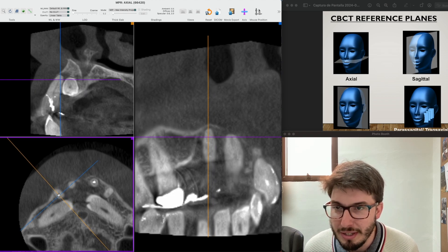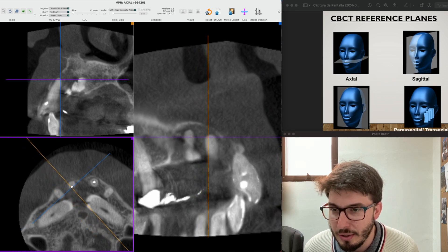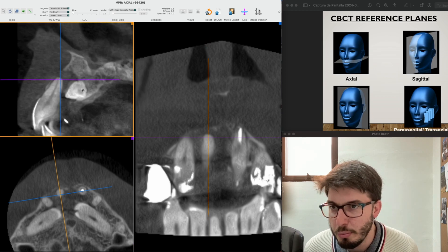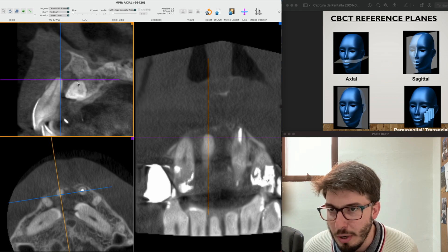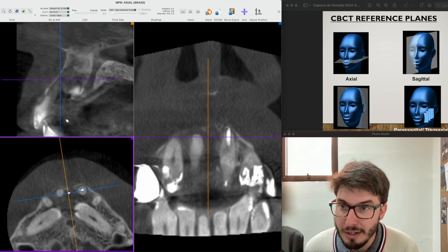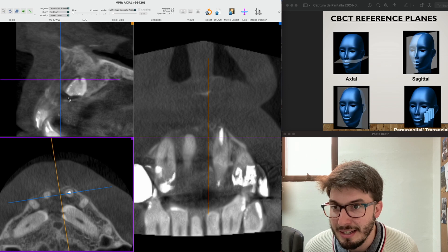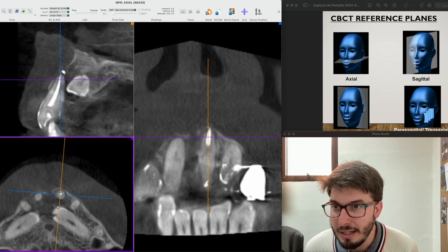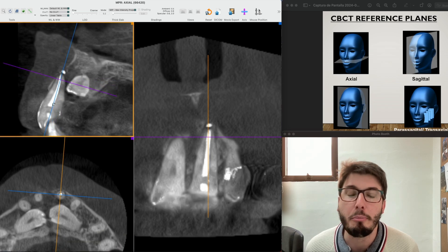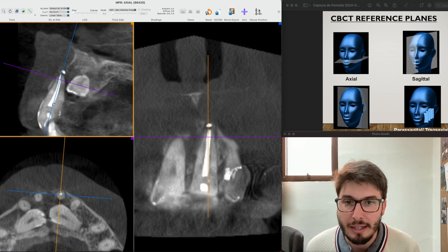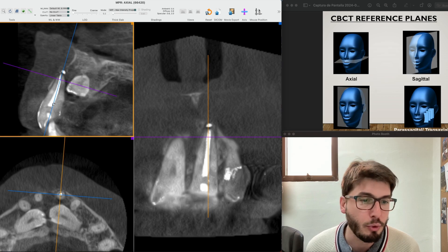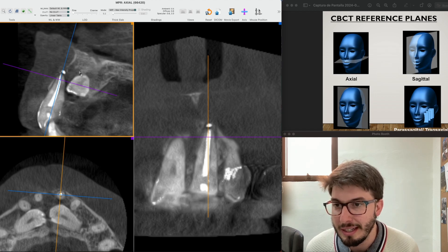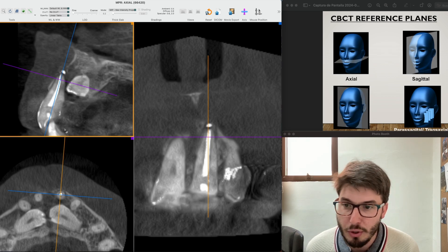We can see the relationship between the crown of the impacted canine and the root of this right lateral incisor. Moving to the central incisor, we see better the buccal plate resorption, but the lesion is still rounded and well-defined — so we already suspect a cyst. For the left lateral incisor, I'm making all axes parallel to it as we should always do. Here we can see overextended root canal treatment with buccal plate resorption, and this could also be a source of infection for this lesion.